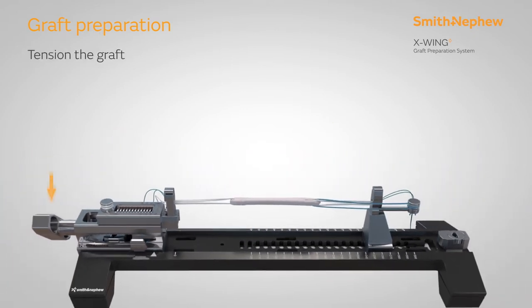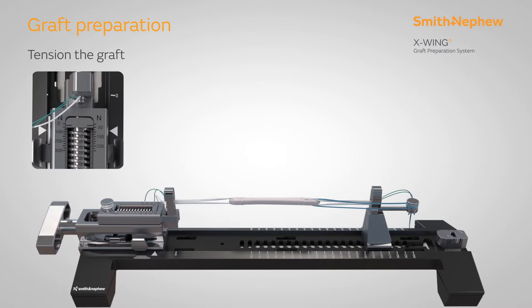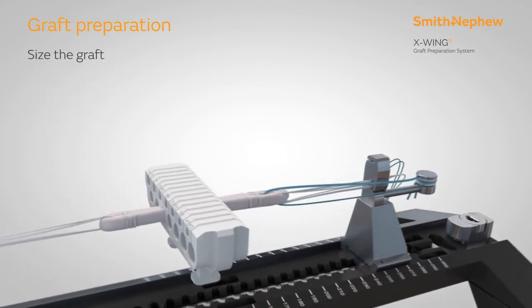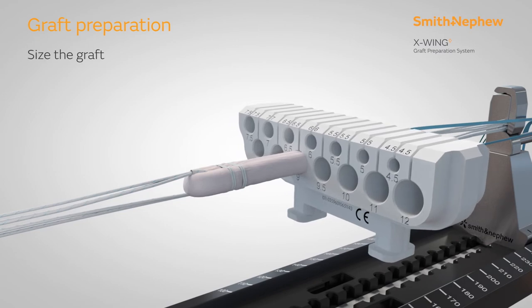Apply tension to the graft by turning the handle on the X-Wing until the desired tension has been achieved, referencing the tension scale on the device. Size the graft diameter with the slotted sizing block.